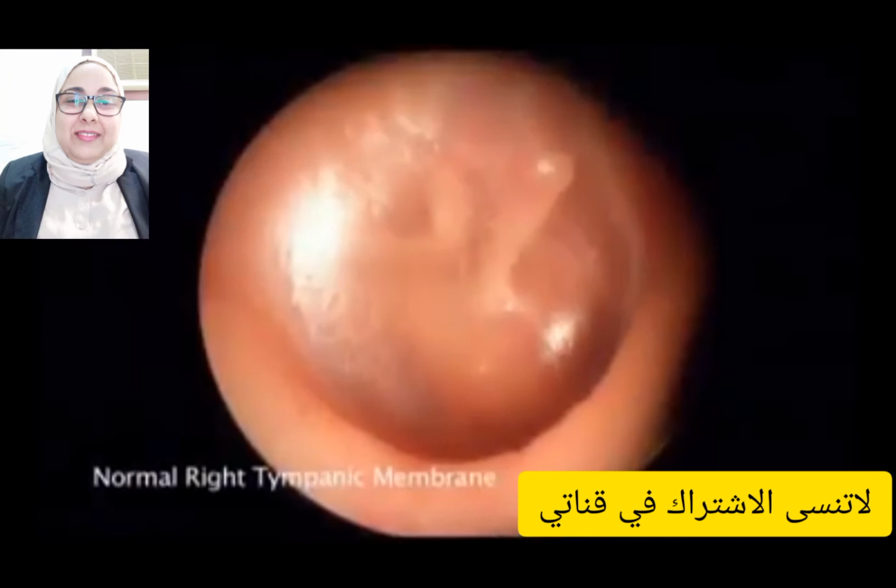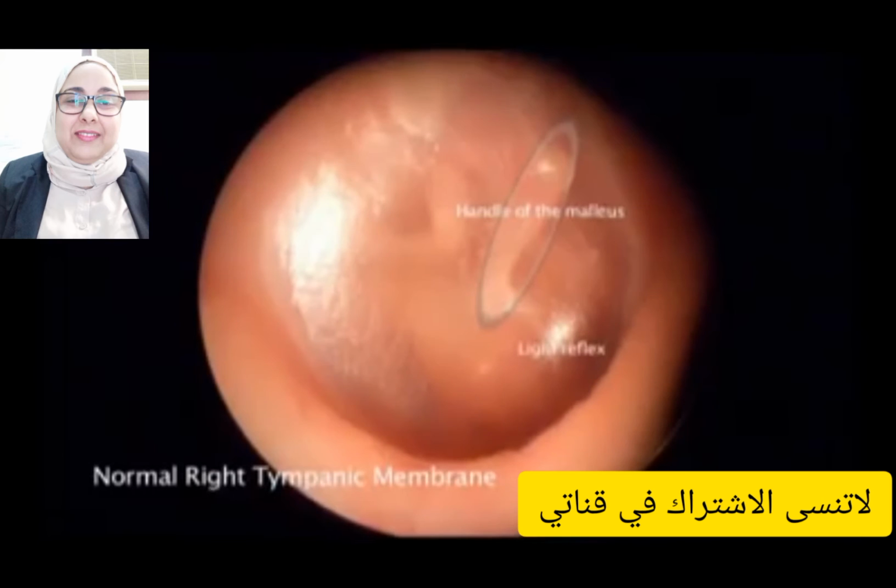This is a normal right tympanic membrane. On a normal tympanic membrane, you should be able to see the handle of the malleus, the light reflex in the anterior-inferior quadrant and the pars tensa. You should look superiorly to see the pars flaccida also.